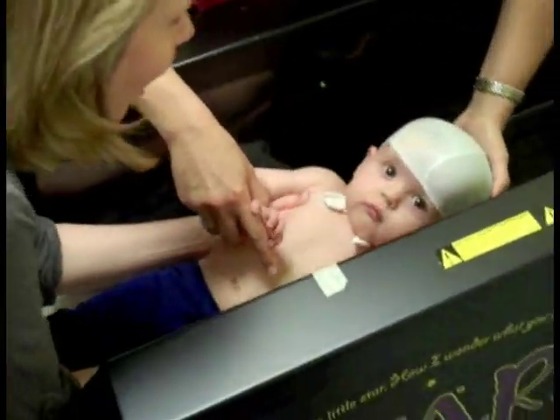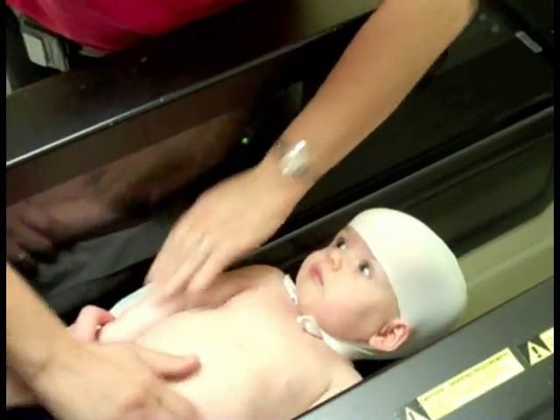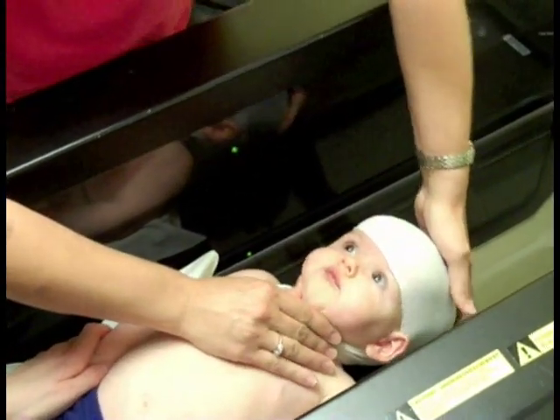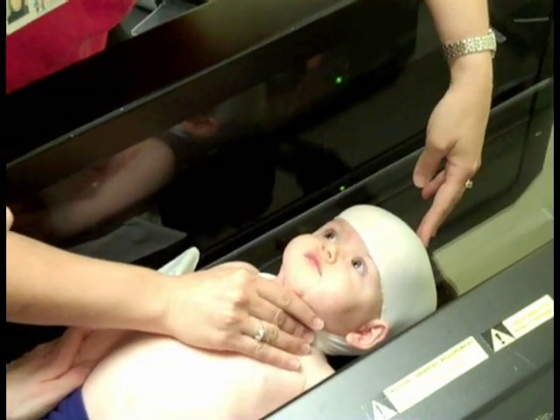Now that we have our star scanner, we do not need to do the casting method. We'll just do a quick 2-second scan and we'll have all the information we need to actually fabricate a cranial remolding helmet if we need to.